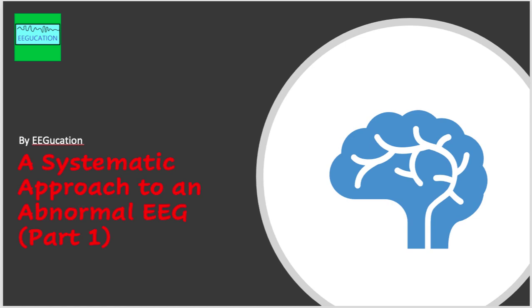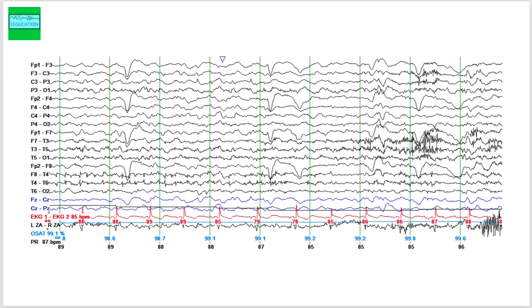Hello everyone. In this tutorial and the next few tutorials, I will walk you through a systematic approach to reporting an abnormal EEG. The patient is a 25-year-old man with a history of medically refractory epilepsy. He has multiple seizure types: atonic seizures, tonic seizures, tonic-clonic seizures, and also episodes of spacing out.